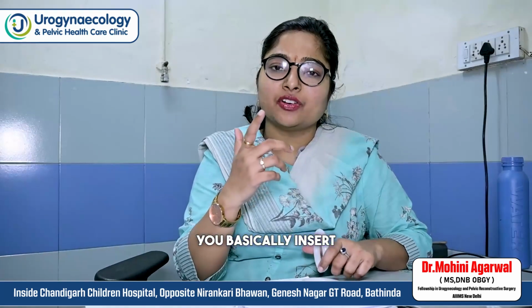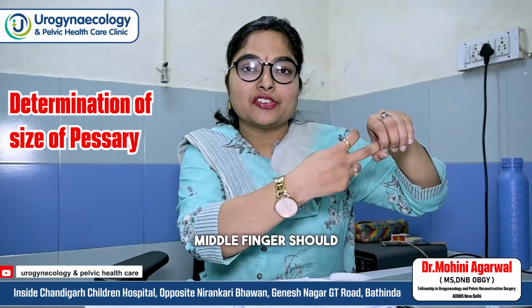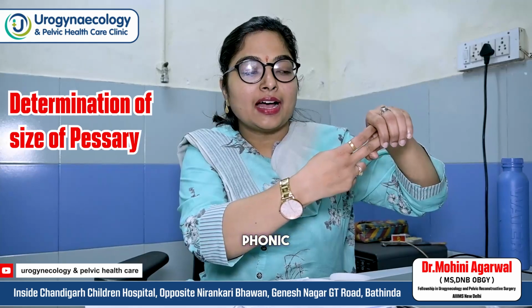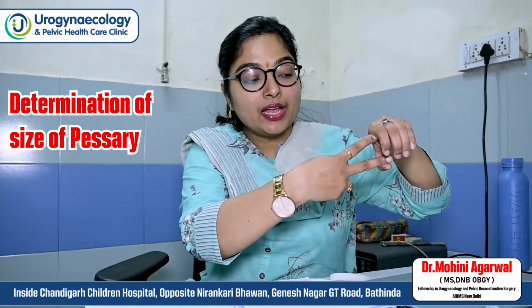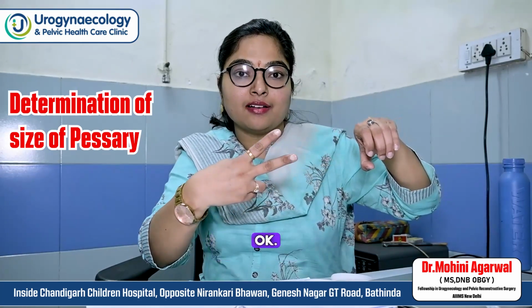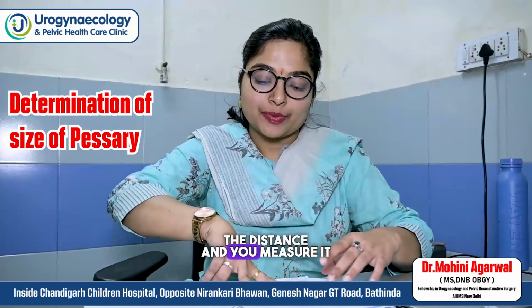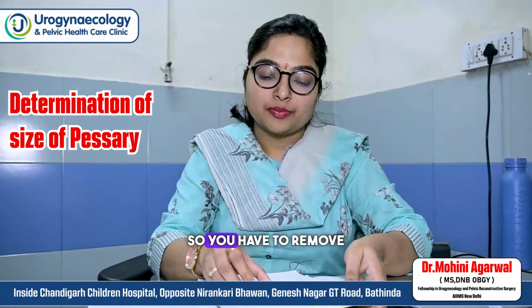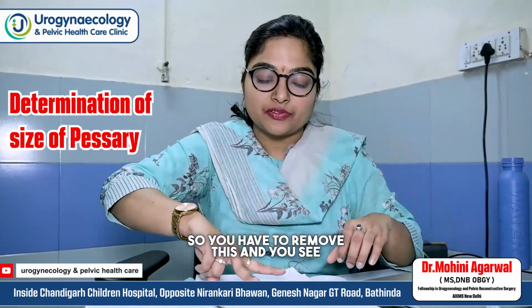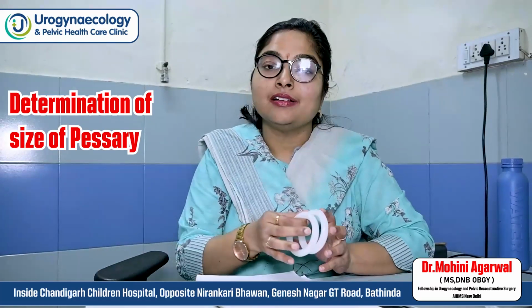Now, how do you take the size? Suppose this is a vagina, so you insert both fingers, the middle and the index finger. The middle finger should be in the posterior fornix, and the index finger just behind the pubic symphysis in the anterior fornix. Then you take it out of the vagina, see the size of the distance, and measure it with the pessary. You see what the size is, and then according to that you insert a pessary.